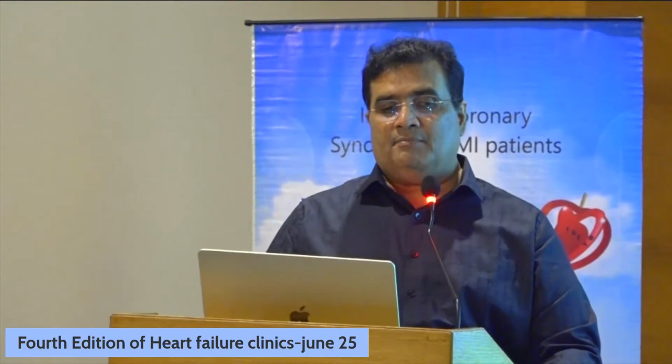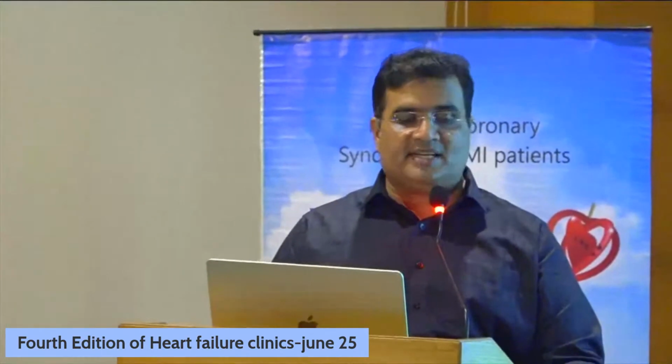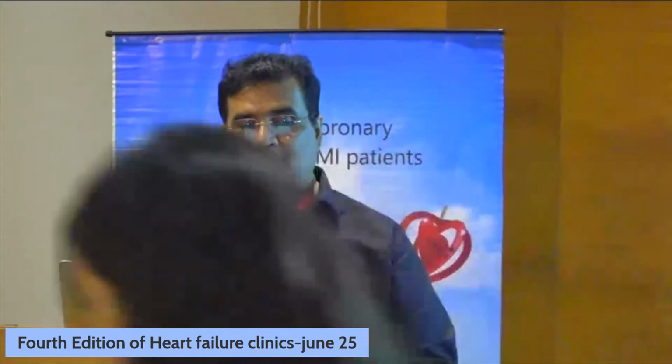The advantage of stress echocardiography, with an exercise ECG stress versus a drug stress test, is that both have similar sensitivity, and stress echocardiography has a similar specificity to nuclear imaging.